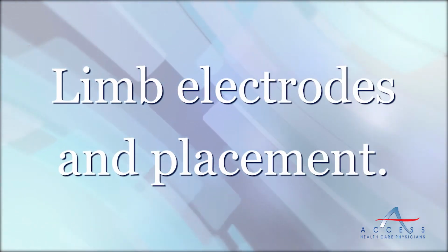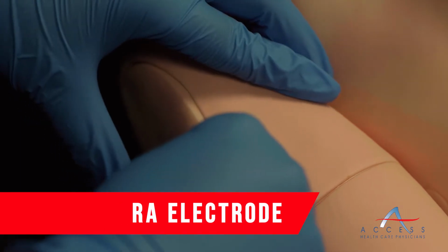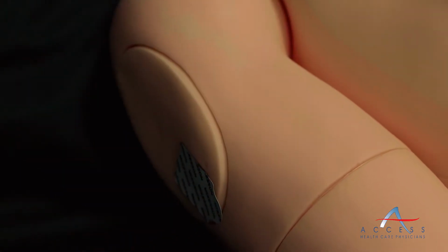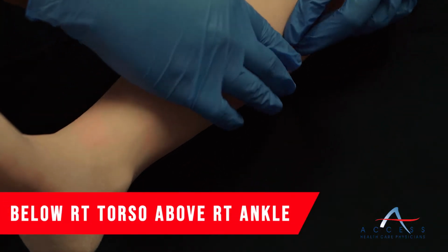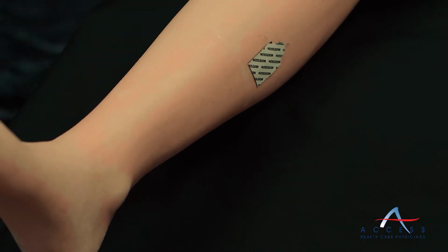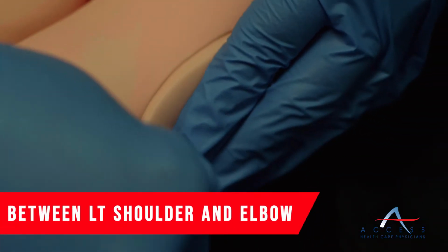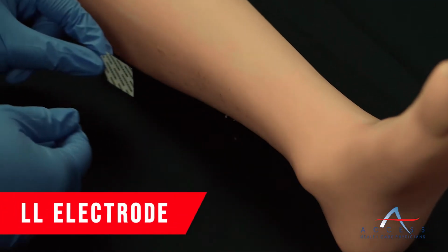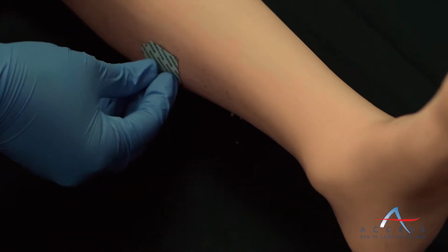Now let's look at the limb electrodes and their placements. The RA, or right arm electrode, can be placed anywhere between the right shoulder and right elbow. The RL, or right leg, can be placed anywhere below the right torso above the right ankle. The LA, or left arm electrode, can be placed anywhere between the left shoulder and left elbow. The LL, or left leg electrode, can be placed anywhere below the left torso and above the left ankle.